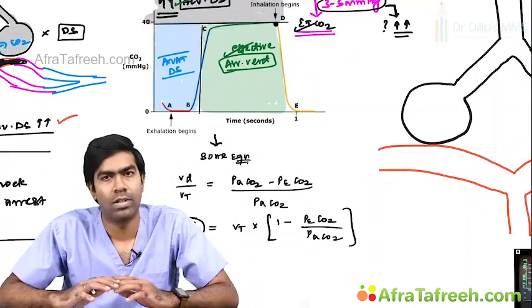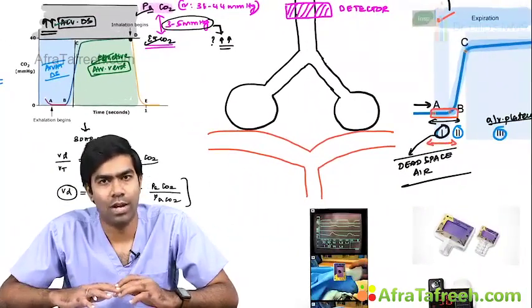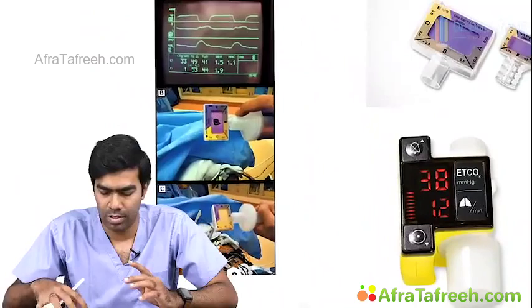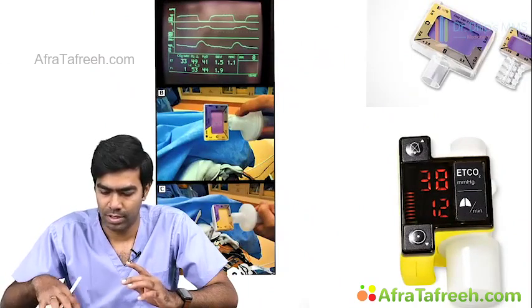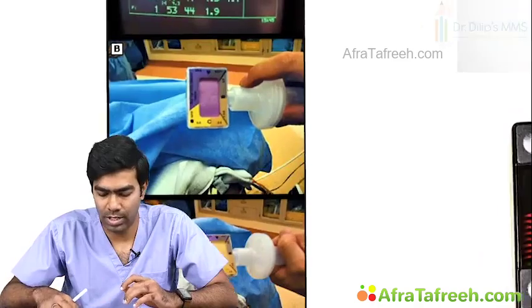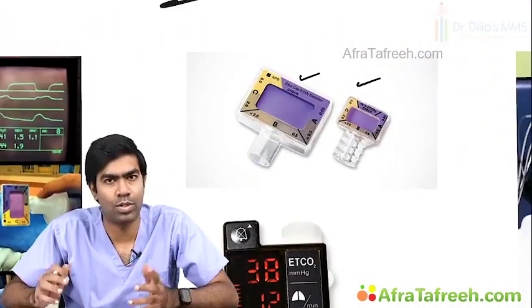That's all. After knowing this, you also have to know what the different types of devices available are. The first one is the standard colorimetric device. This could be an exam question also.